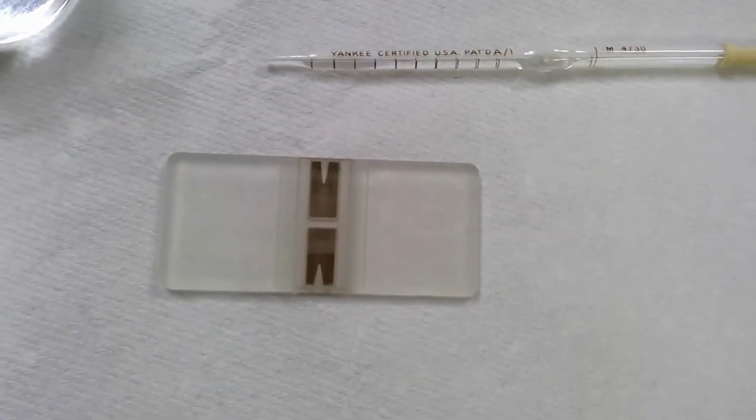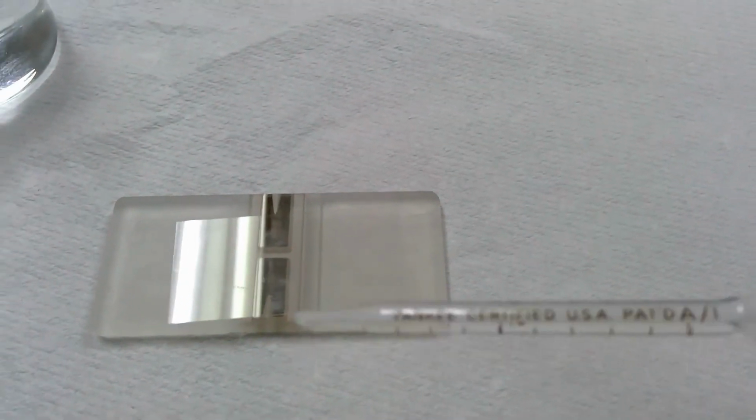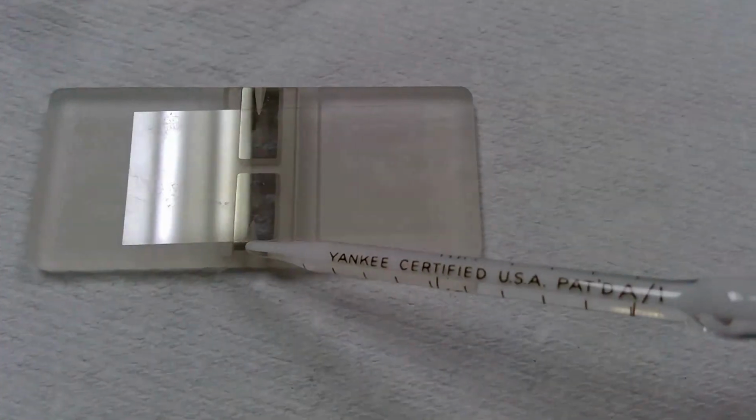So then what we would do next is we put our cover slip on here, and you make a drop of the diluted blood form at the tip, and you touch it right there to that base of that triangle.